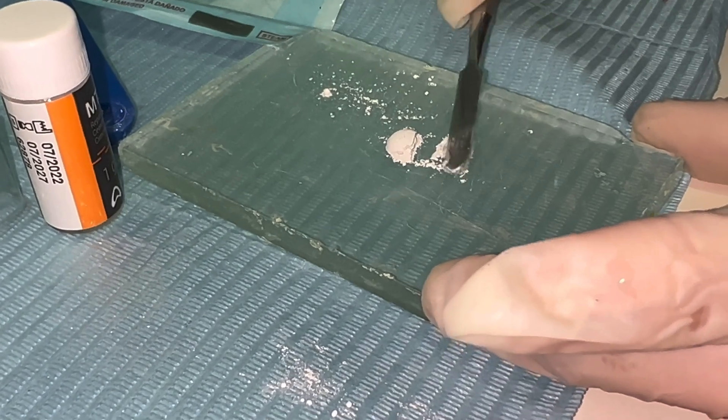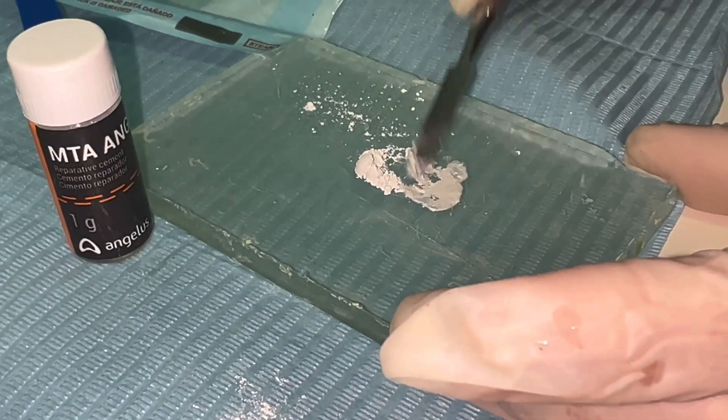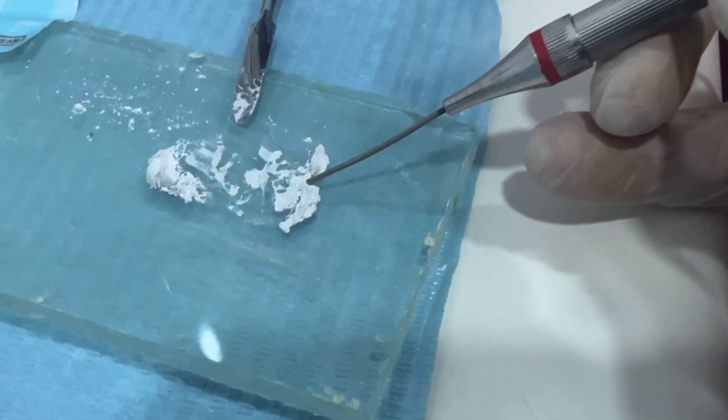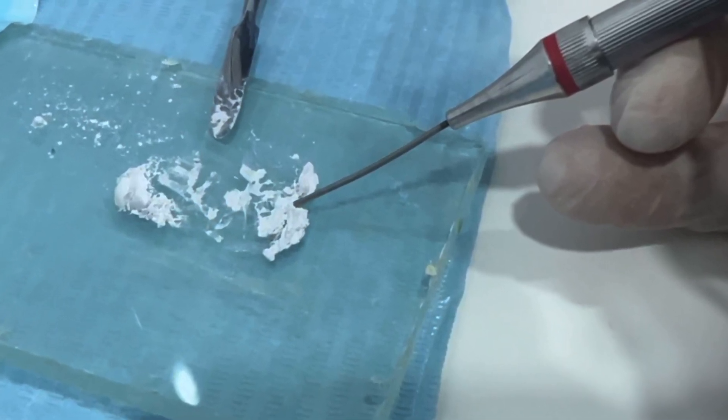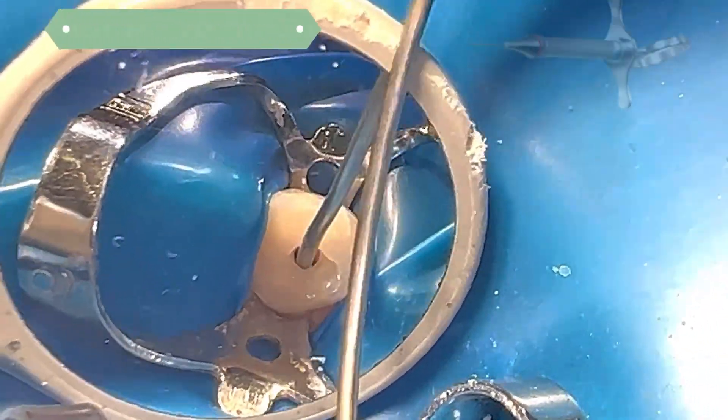In this case, we use the fast-setting Angelus MTA. To place the MTA in the root canal I use MAP1, which is the best I have used. If you know of something better, don't hesitate to leave it in the comments.